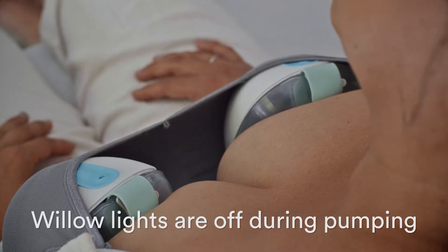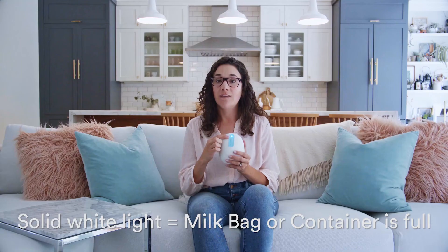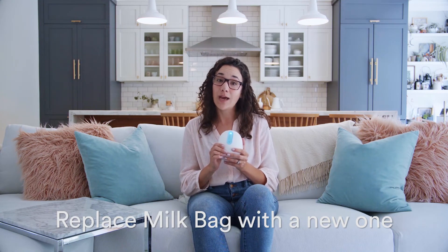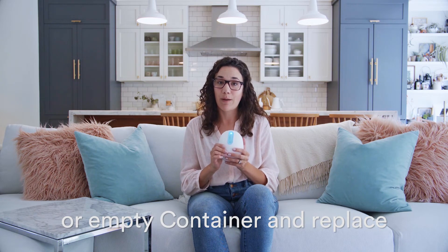There are no lights on when you're pumping. This light will be solid white if the milk bag or the container is full. If this happens, you need to remove the milk bag and replace it with an empty bag, or remove and empty the container before replacing it and continuing to pump.